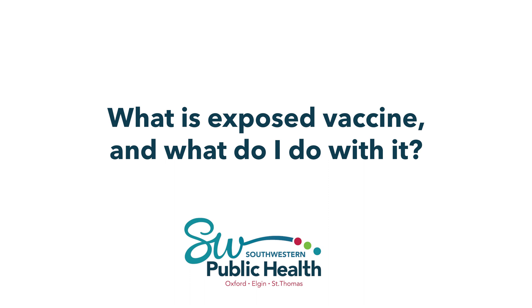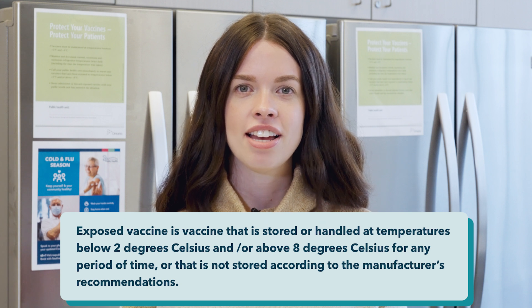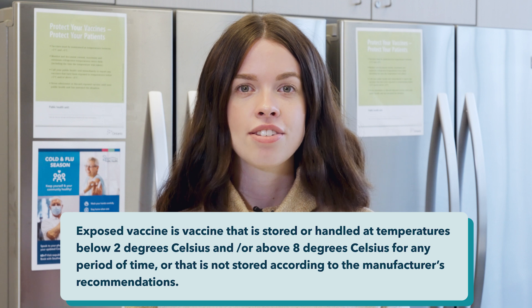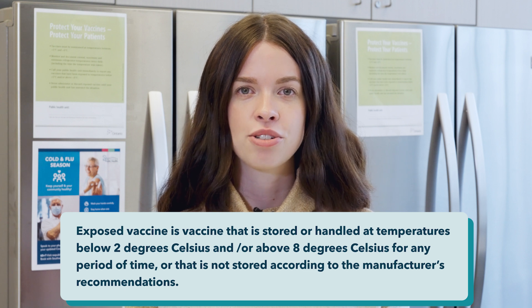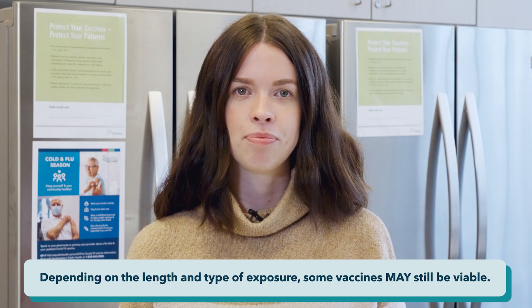Exposed vaccine is vaccine that is stored or handled at temperatures below two degrees Celsius and/or above eight degrees Celsius for any period of time, or that is not stored according to the manufacturer's recommendations. Depending on the length and type of exposure, some vaccines may still be viable. Contact the Southwestern Public Health vaccine team to assist you in determining if the vaccines remain suitable for use.